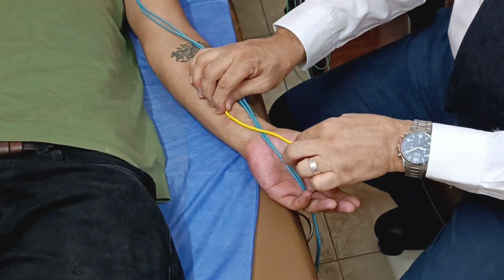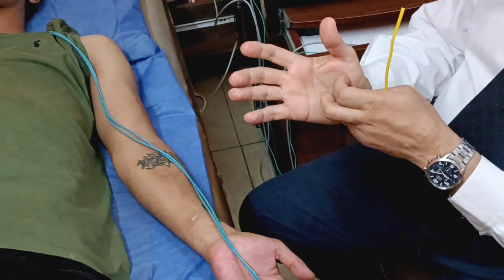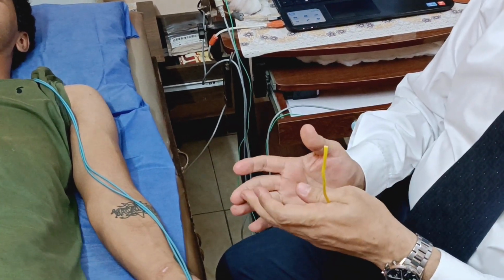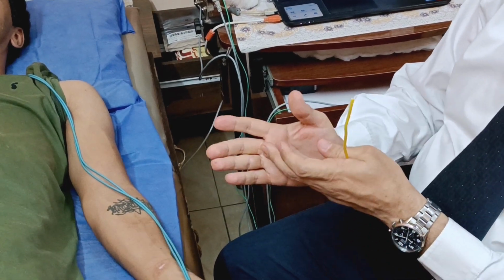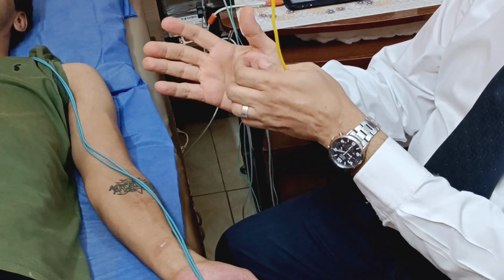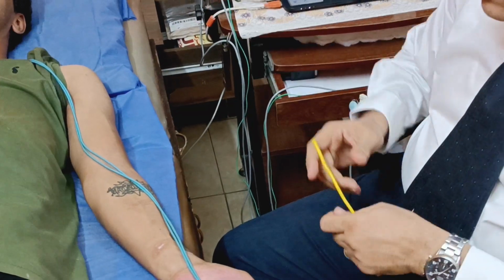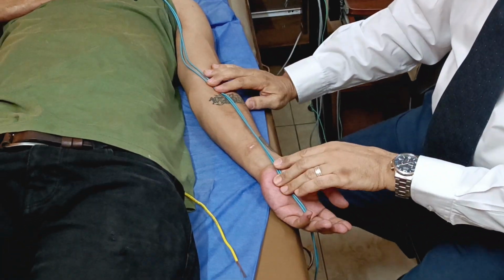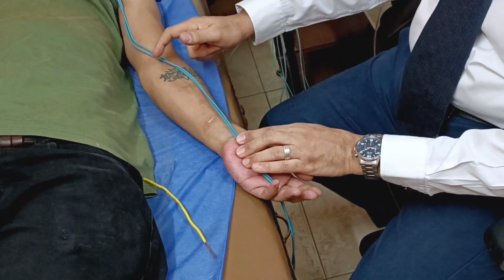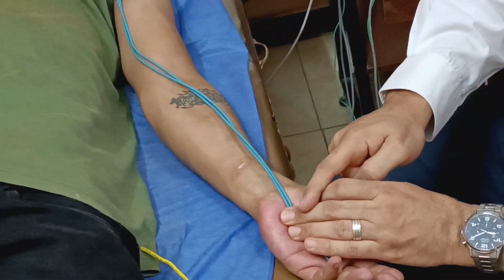So the patient will get some clinical signs. The patient says, I have some itching in this area. So I will ask if there is numbness at the 3.5 fingers, which is the terminal sensory territory of the median nerve. The patient says no, I just have some itching in this palm area. So your query and clinical diagnosis will be proximal median neuropathy syndromes, or pronator teres syndrome, affecting the anterior interosseous as well as the palmar cutaneous.